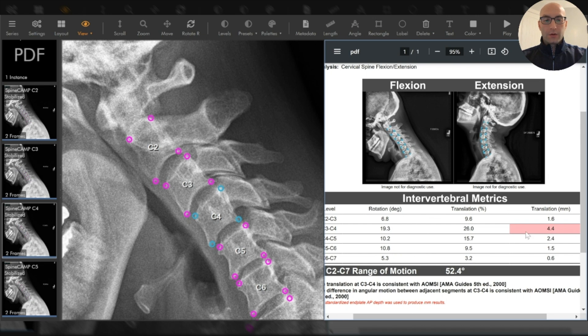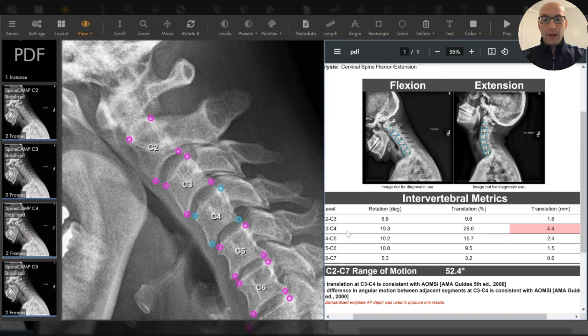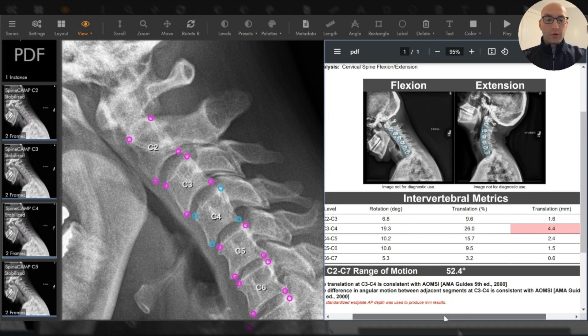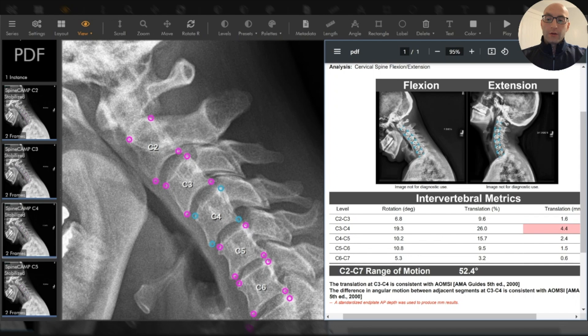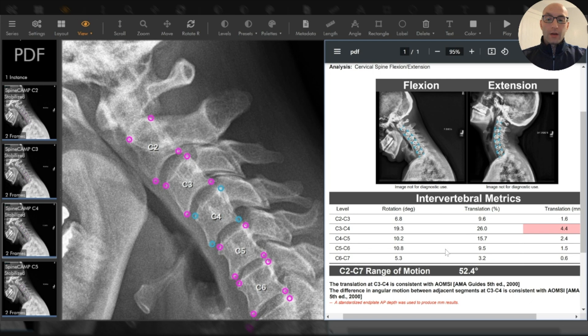You can see very quickly that there's an abnormal amount of translation over four millimeters at C3 C4. And the report goes on to tell you that that amount of translation is abnormal and consistent with criteria for alteration of motion, segment integrity, or AOMSI, as defined by the AMA guidelines for permanent impairment evaluation.